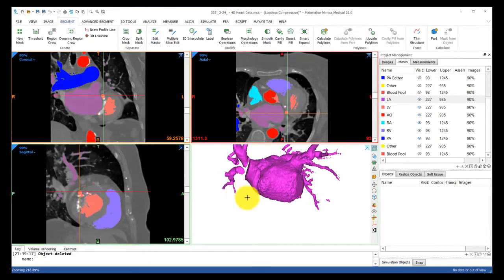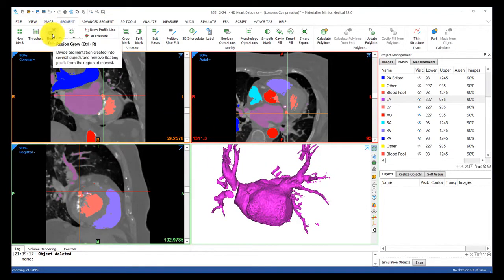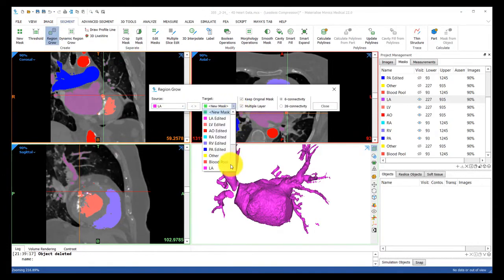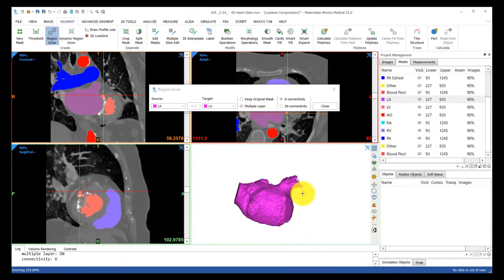Once I'm all set with my edits, I'll go ahead and do a quick region grow from the segment tab, which will get rid of all of those floating parts that I left behind.